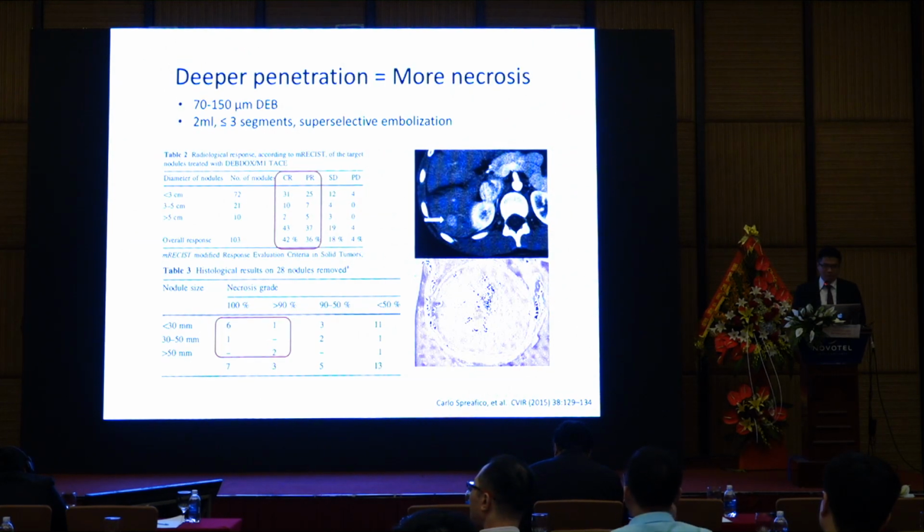As the technology developed, we have smaller beads of around 100 micrometers. In this study, you can see that for smaller tumors, you can get more than 50% necrosis, complete response and partial response.